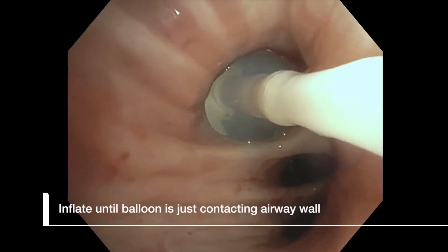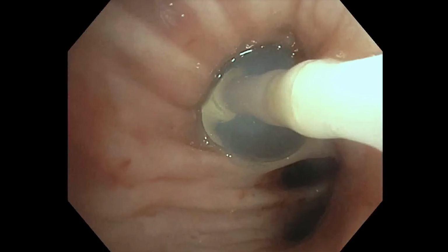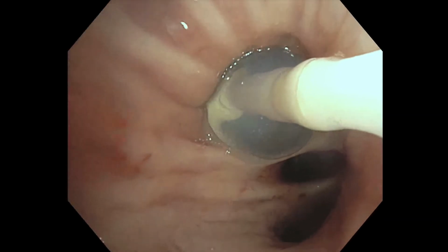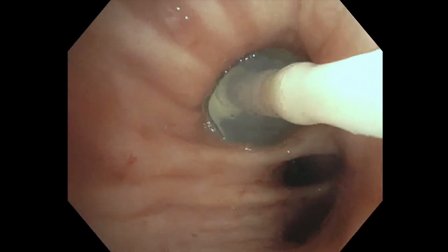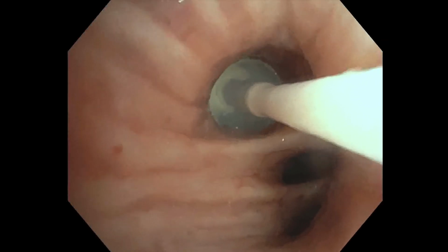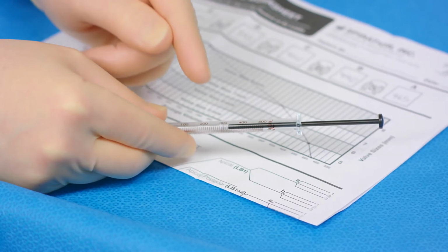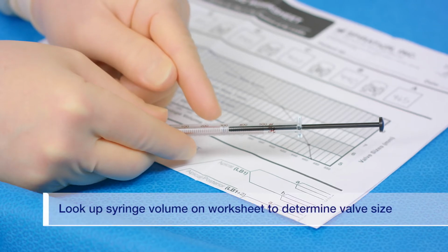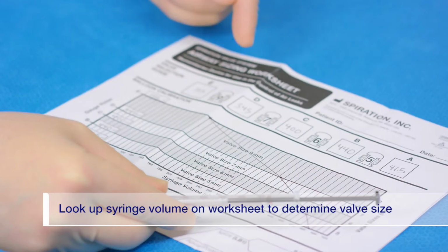Inflate the balloon until it is contacting the entire circumference of the target site. The bronchoscopist should feel a slight tug when moving the catheter back and forth to assure a good fit, taking care not to over or underinflate, as this can result in the selection of an improper valve size. Using the worksheet that was filled out during balloon calibration, look up the syringe volume on the worksheet table and select the indicated valve size.